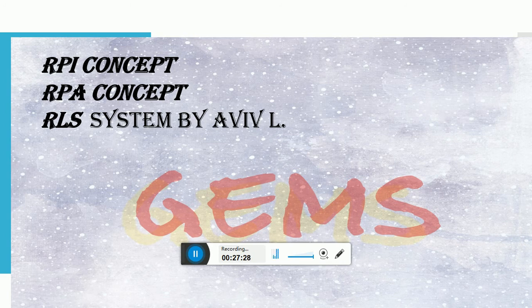Next you have RPA. RPA is nothing but the modification of the RPI system. It is just similar to the RPI, but instead of I bar, an Akers or circumferential clasp retentive arm is fabricated. That is the RPA. Advantage is it is easier to grasp for the removal of the prosthesis. It can be used in case of large tissue undercut and so on.